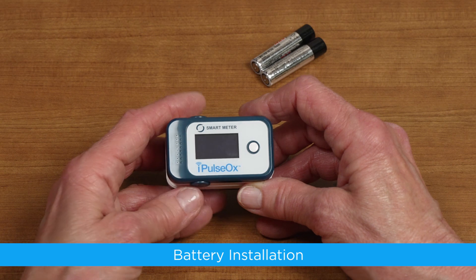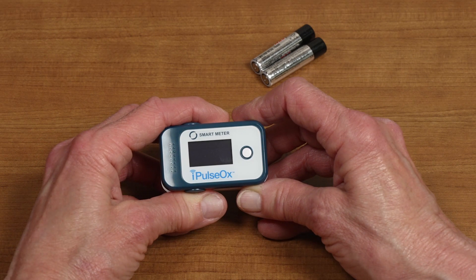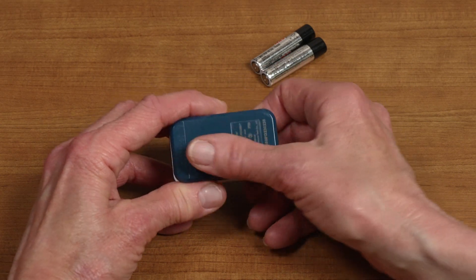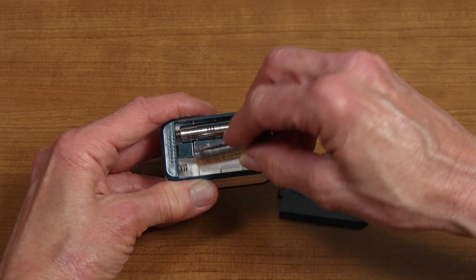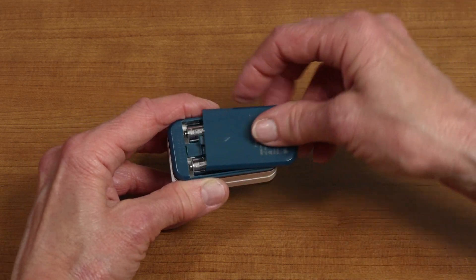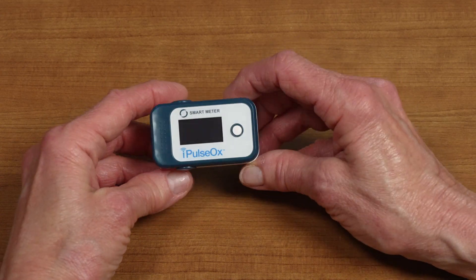Battery Installation. To install batteries before your first reading, or to replace existing ones with new ones, remove the door of the battery compartment located on the bottom of the meter. Install the batteries according to the diagram in the battery compartment to ensure correct polarity. Once the batteries have been installed correctly, replace the cover on the battery compartment.